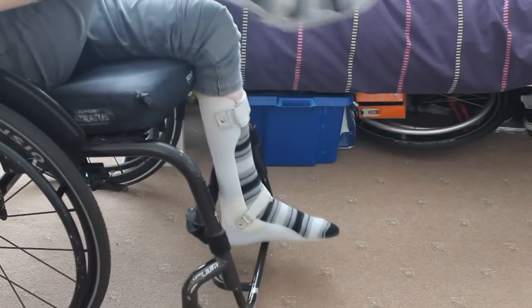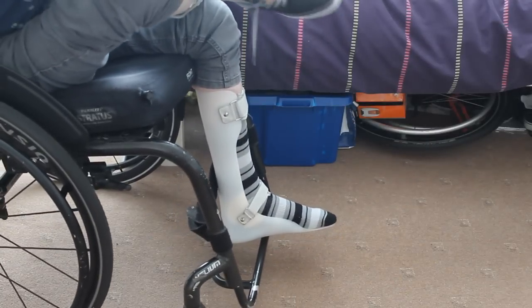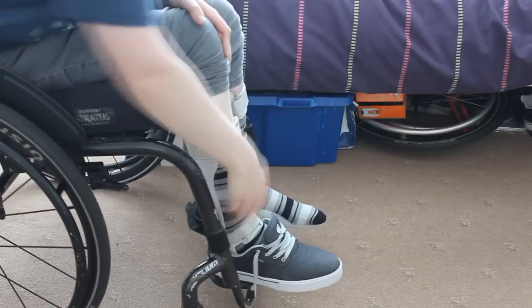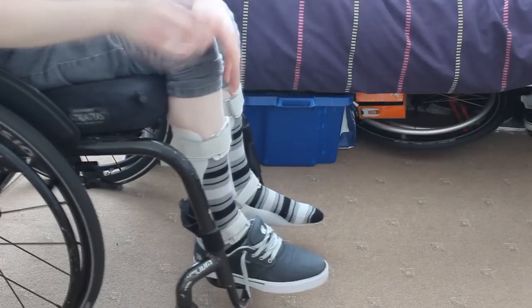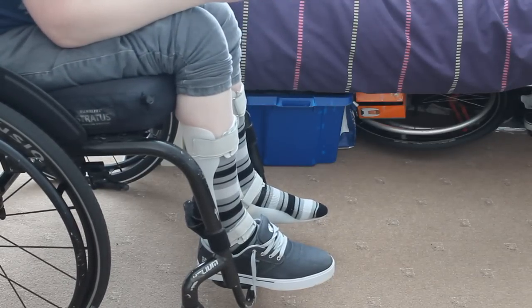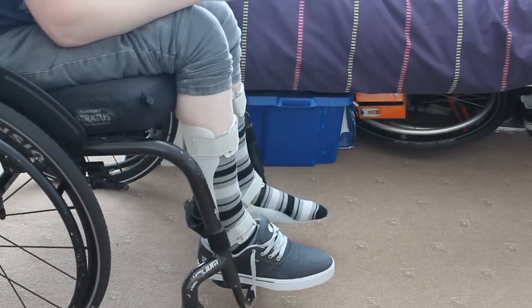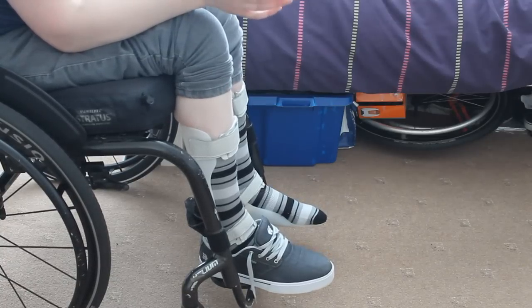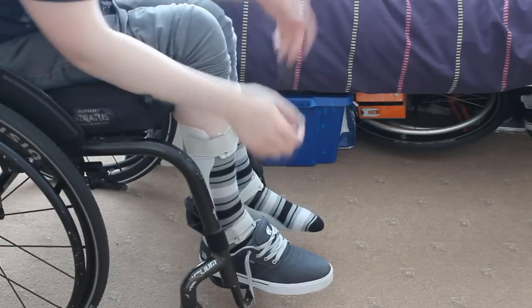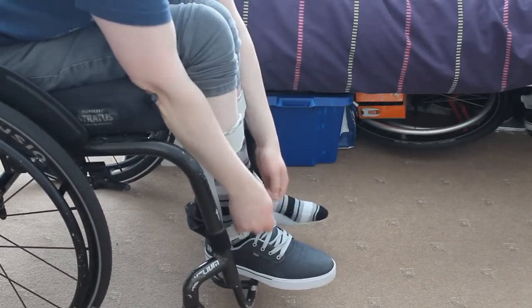I'm going to put the shoes on now — that's just the standard way you put a shoe on. There we go, the shoe's on. Now when you're buying shoes for splints, a good tip is to get shoes that are a size up — maybe just one size up. I'm normally a size 10 so I just buy a size 11 for the splints and that solves all the problems, though it depends on what type of shoe it is.